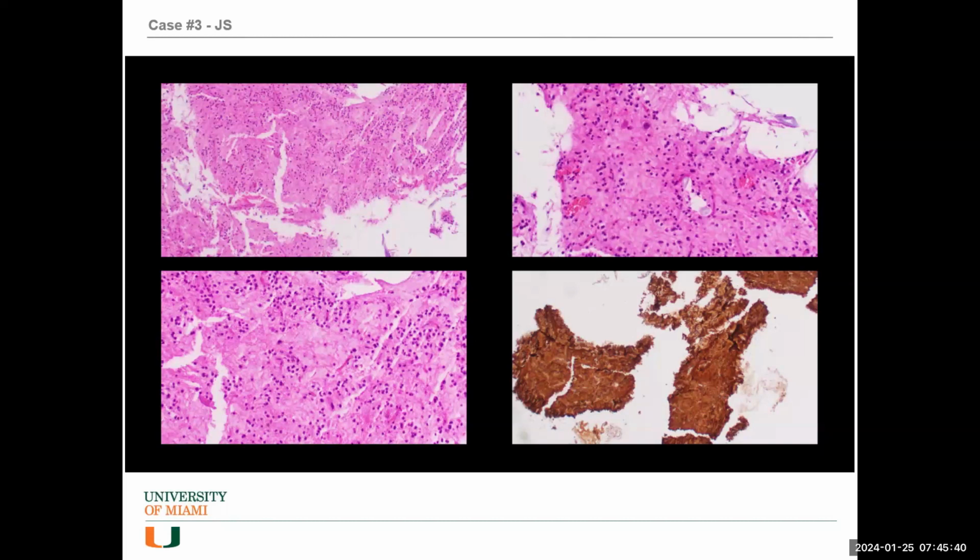The third layer is doing some immunohistochemistry, looking at the morphology carefully. What morphology shows is a myxoid background, as you can best see in the left lower picture. And there are some nests of innocuous looking, benign looking, round tumor cells, occasionally, actually more than occasionally, making perivascular rosette-like structures, not necessarily ependymoma-like. Especially the left lower picture shows these cells forming rosette-like structures.